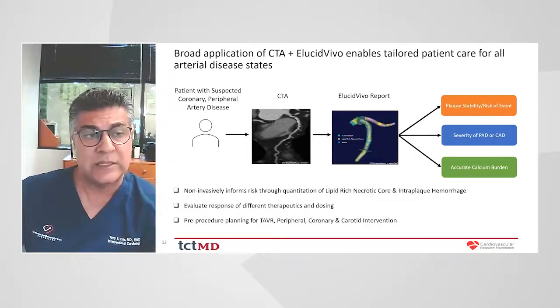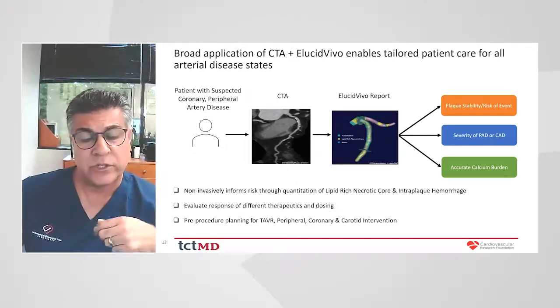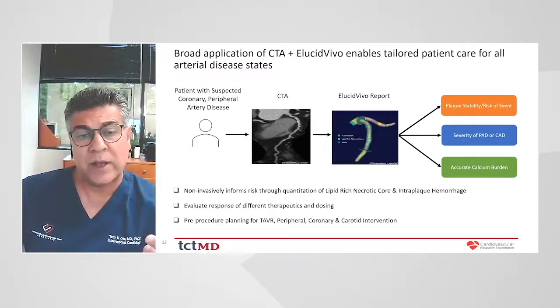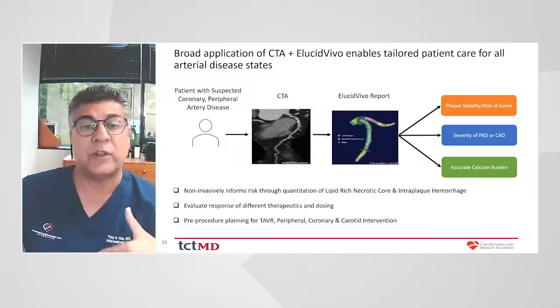So you take the CT scan with patients that have lower extremity disease or carotid disease, and then look at their plaque stability, and then take into account other portions of their evaluation, whether it's their demographics or their social determinant risk factors, or other things that they're on medication-wise, as others mentioned. Those things may play into what we would consider to be non-supervised machine learning identification of high-risk plaques, things that we wouldn't necessarily find unless you had large databases of information.